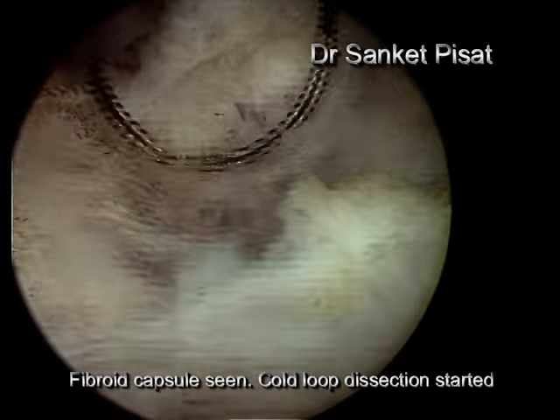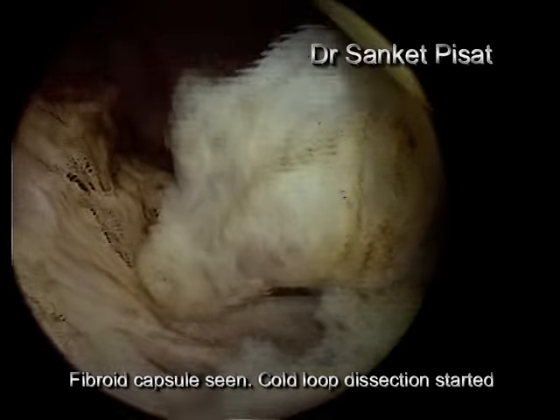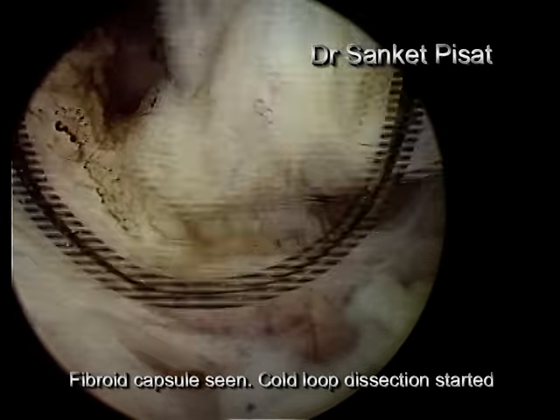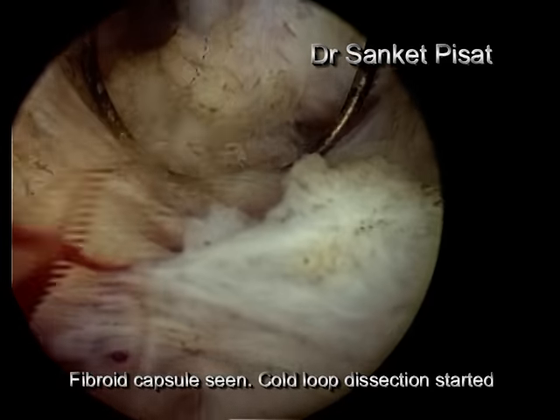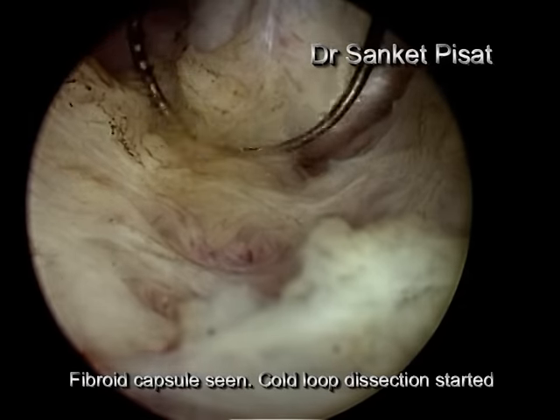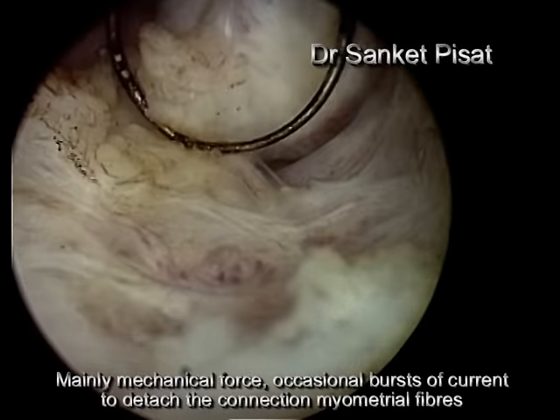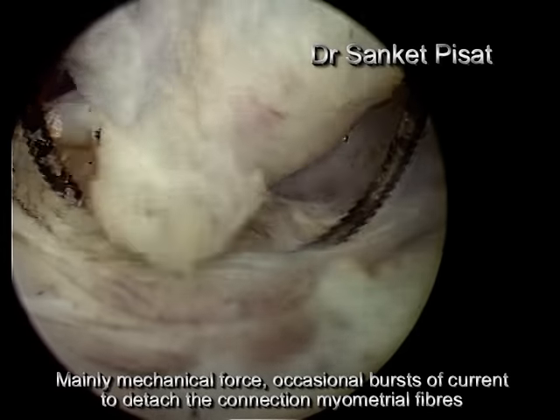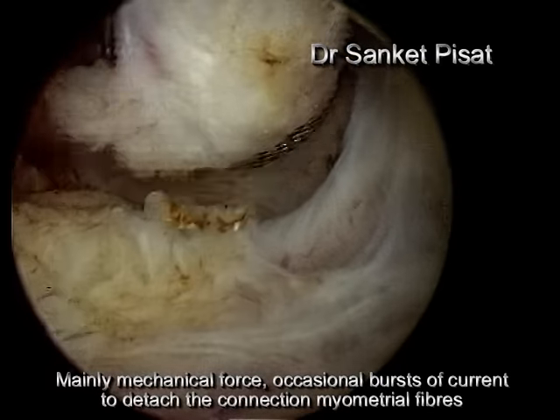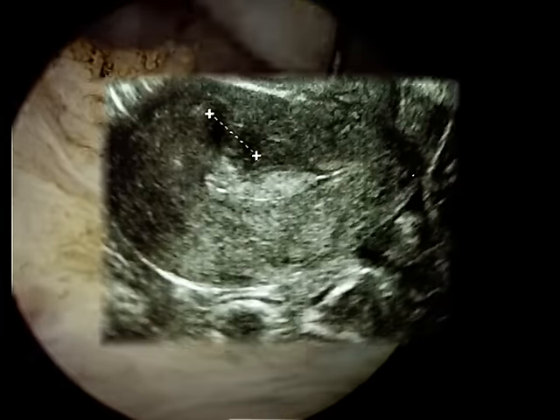It is at this stage that the surgeon dissects between the fibroid capsule and the normal myometrium using a cold loop, that is only mechanical force, only activating the electrode in short bursts of current to detach the myoma from its attachment to the myometrium. Using this technique, the myoma is gradually peeled off from its attachment to the normal myometrium. The risk of perforation is minimized, and also the risk of thermal damage to the surrounding endometrium is minimal. Here, the fibroid is seen to be completely detached from its base.